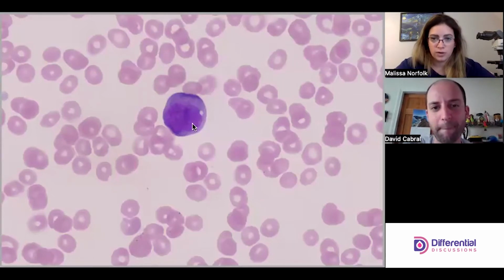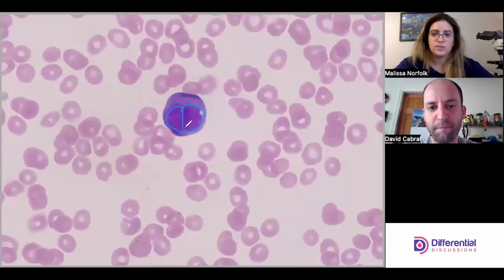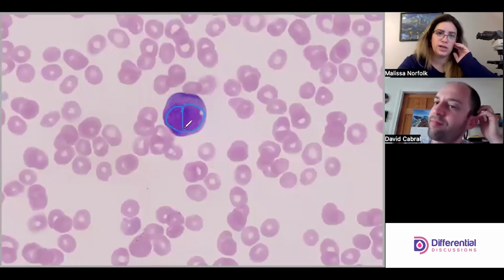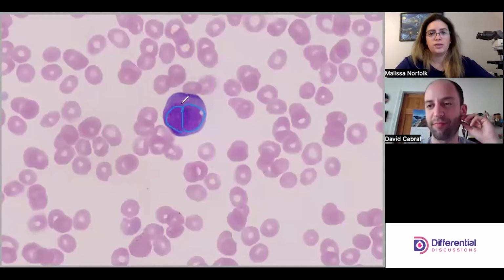It's bilobed looking, with one lobe here and one lobe here. Sometimes a lobe is overlapping another lobe and you can only see it partially. That's fairly common, but this kind of bilobing appearance, right? It's like a little caterpillar head with little antlers.